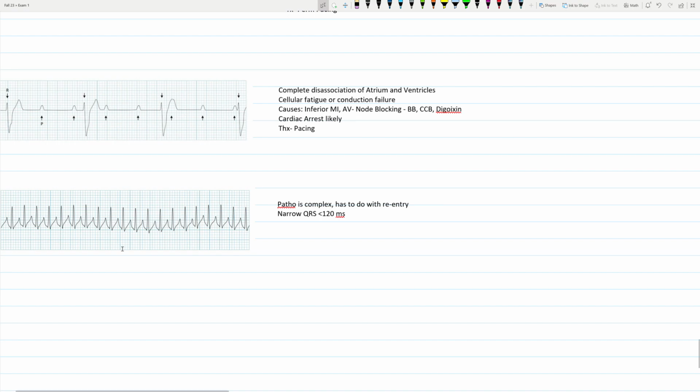And basically, what that would look like is if you're looking at these QRSs, and all of a sudden it would be a hard rapid push followed by a flush because we want all that adenosine to get to the cardiac myocytes at the exact same time. And what's going to happen is you'll see this rhythm, and all of a sudden you'll see asystole or PEA for about 2-3 seconds, and you're sitting there staring at the rhythm strip. You're like, oh gosh, is she going to come back? Is she going to come back? And then boom, all of a sudden it picks right back up again. It may or may not work. They might go right back into SVT, or they might go into sinus tach, or they might go into sinus rhythm.